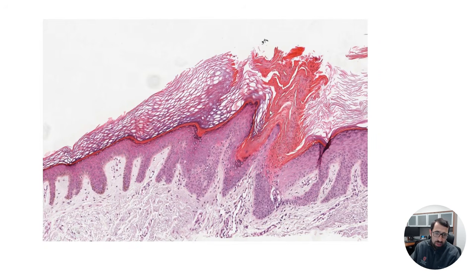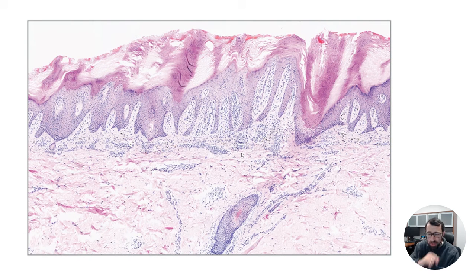Here again becomes a 1-second diagnosis. You see this mound of 45-degree parakeratosis overlying an area where you have dyskeratotic keratinocytes, and so this is a cornoid lamella consistent with porokeratosis. This is a cool one I kind of just clipped in there back in the day, probably low yield for boards purposes, but it's a slide where you'll see multiple cornoid lamellae.